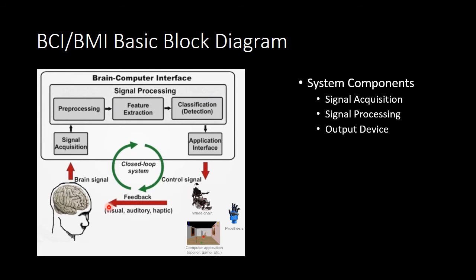The important point to notice here is that this whole system involves two adaptive controllers, that is, the brain and the BCI. So the success depends on the interaction of the two adaptive controllers. The user must develop and maintain good correlation between his or her intent and the signal features employed by the BCI. And the BCI must select and extract features that the user can control and must translate those features into device commands correctly and efficiently.